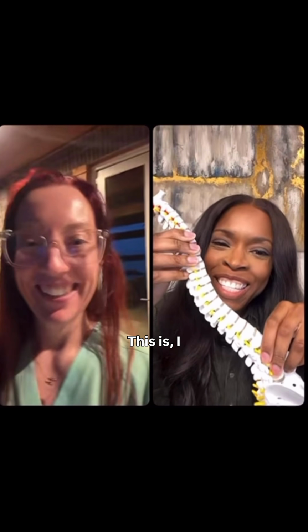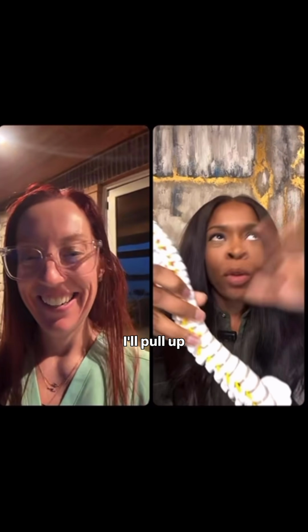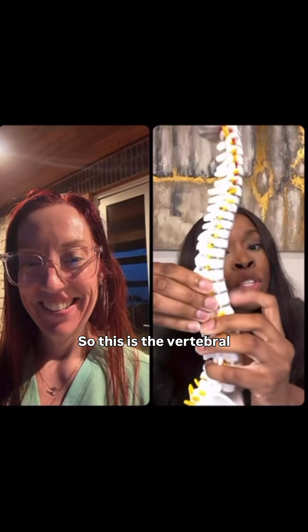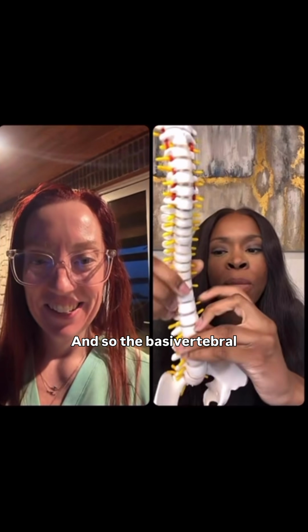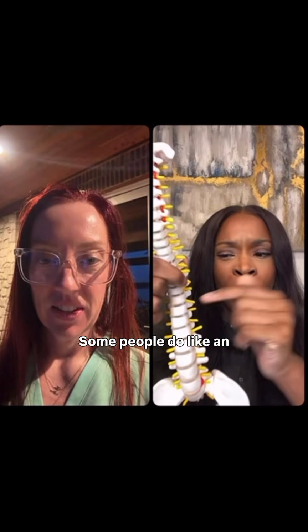Thank you. So, I love my spine model. I'm always in clinic pulling up pictures and using the spine model. So this is the vertebral body, and the basivertebral nerve kind of courses this way. We go in here, it's a pedicular approach. Some people do an extrapedicular approach as well. And then we can go ahead and ablate the basivertebral nerve.